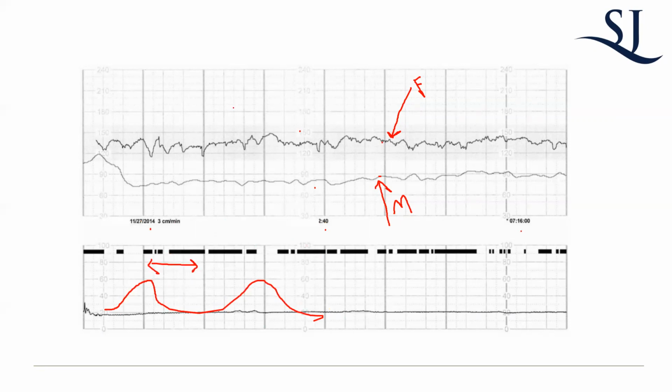Something very important to know about these: they are not exact measurements, okay? They're always an estimate. There's no computer algorithm saying what exactly it is. It's truly a visual estimate. And by virtue of that, it doesn't have to be exact. Whether it's 135 beats per minute or 140, it really doesn't matter as long as it's normal, okay?